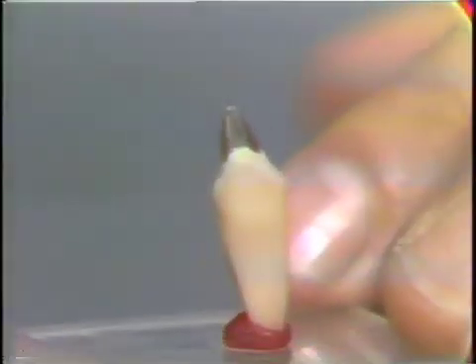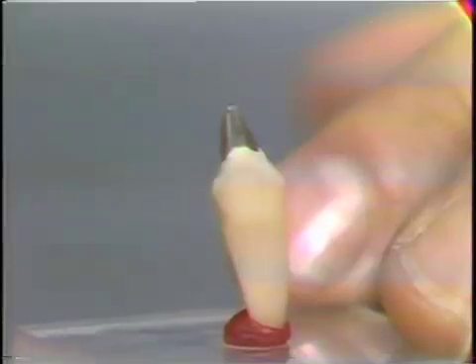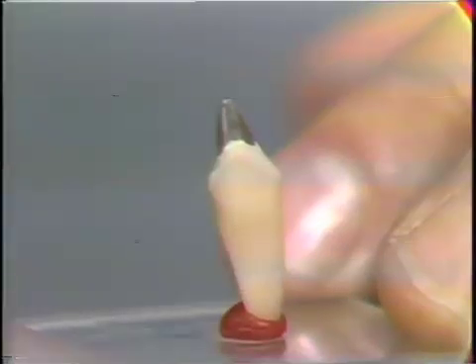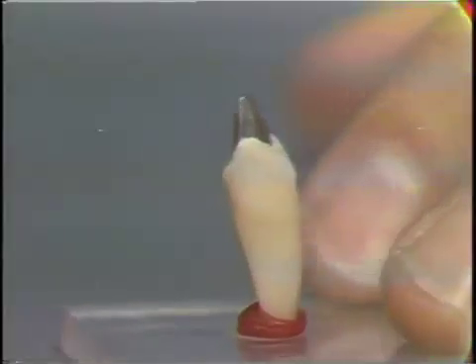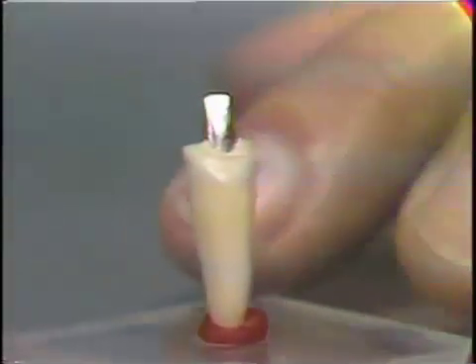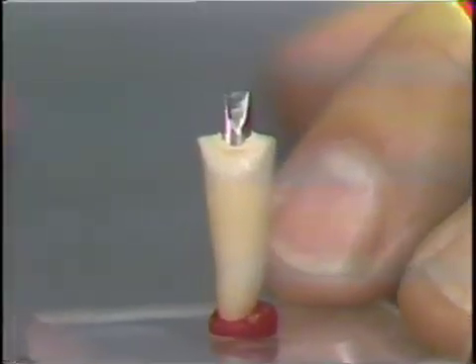If we turn now to the other model, which we looked at the beginning, which shows the finished cemented preparation, and we take a close look at this, you can see, I think, the finished outline. On the left-hand side of the screen is the labial surface, on the right-hand side is the lingual surface, and you can notice now that the incisal is much thinner than it was previously, and I think you can recognize that it now has something of the shape of the regular veneer crown preparation as it's done on a vital tooth.